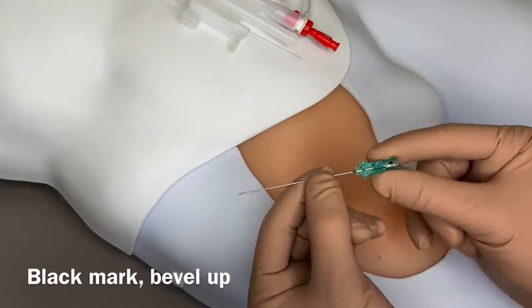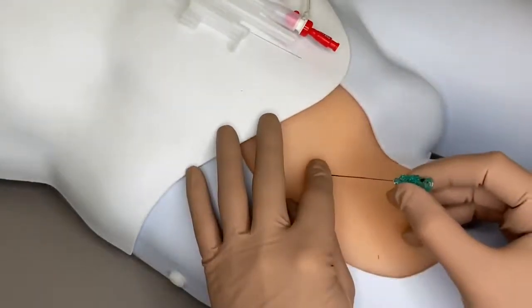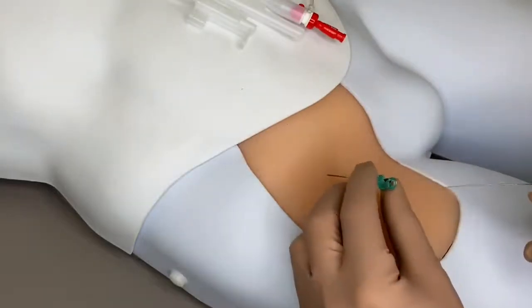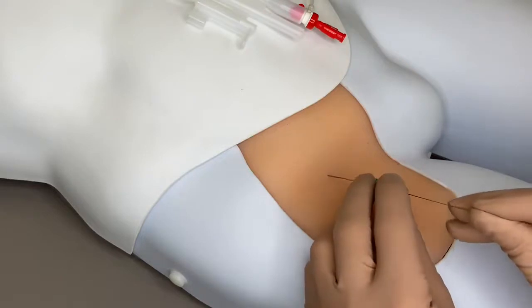Keeping the bevel up, use the 21 gauge micropuncture needle to puncture the common femoral artery. Once the needle enters the artery, blood will be seen dripping from the green hub, which is not shown. Advance the flexible tip of the 0.018 inch guide wire into the vessel, ensuring that there is no resistance.